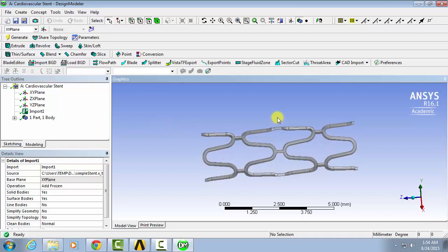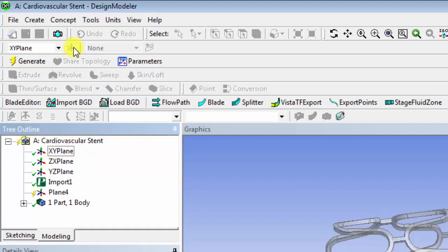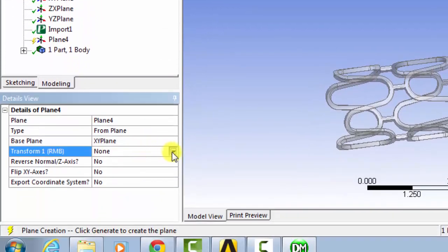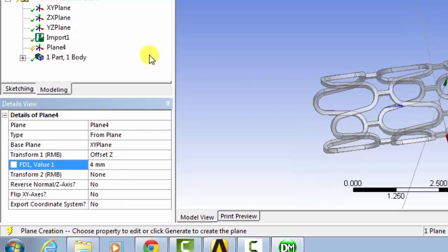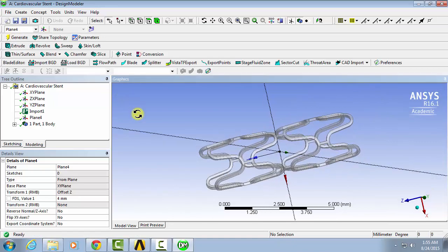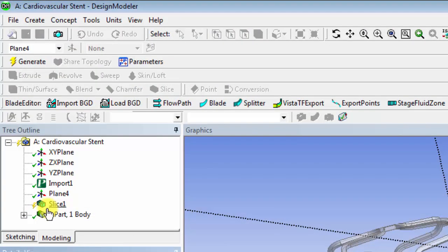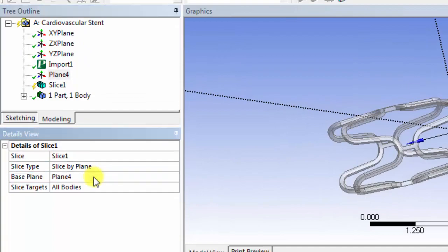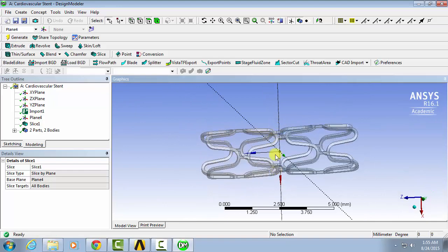So the first cut we'll make is on the XY plane right through the center of the stent. So we'll create a new plane by selecting XY plane and then selecting new plane, and then we'll offset from the XY plane by Z 4 millimeters to the center of the stent. And then we'll click Generate to generate the plane. From there, we can go to Create, Slice, and select that plane that we just made. And then by selecting that and clicking Generate, we'll create two separate bodies, cut straight down the center of the stent.